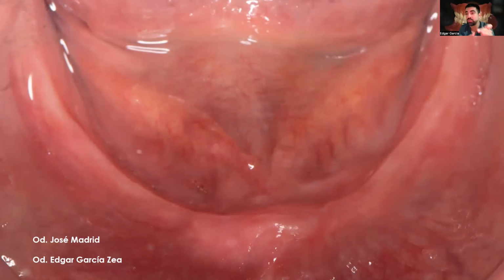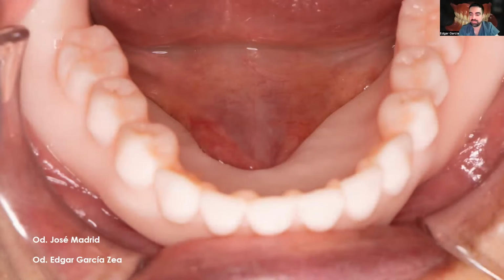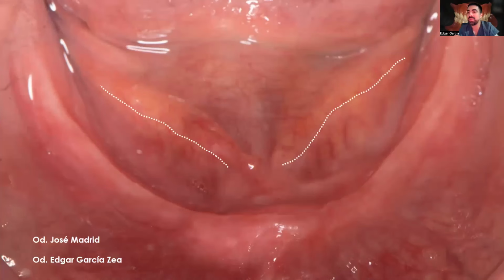As you can see, this patient has a poor amount of spongy tissue, but also the tongue, I cannot see the tongue. It's super, super back. But we have to compensate for this. We have to thicken this area. So as you can see in this prototype, the area is covered, and in this patient we have a lot of retention. But if we don't do this, it's going to be easy for the patient to break the sealing.